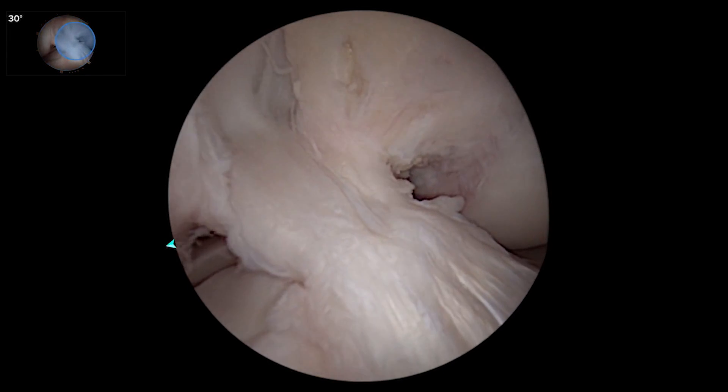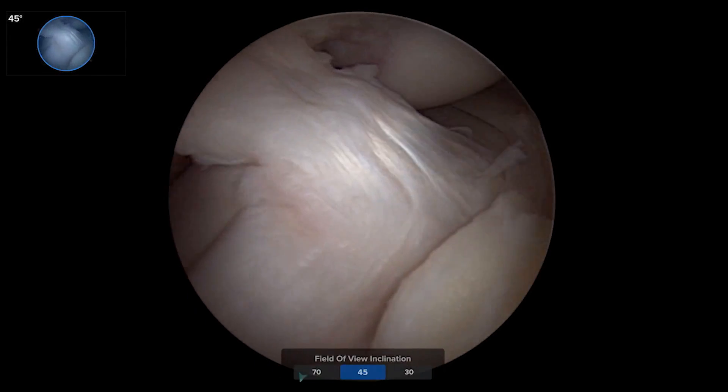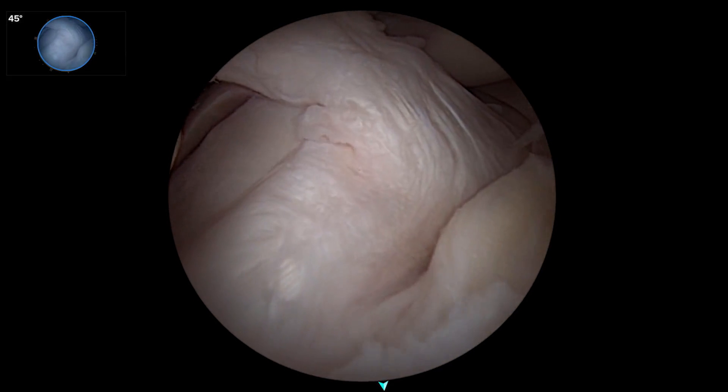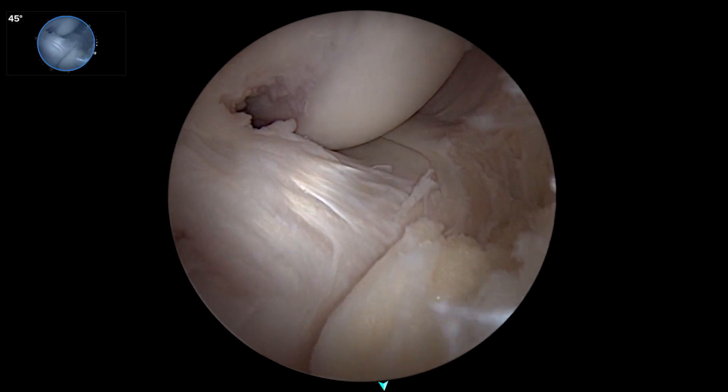If we're looking up at the front of the knee and go to the pano view looking down, we see the anterior horn of the lateral meniscus, the inner meniscal ligament coming around, and the anterior horn of the medial meniscus.